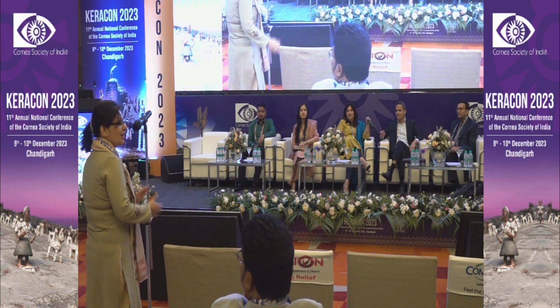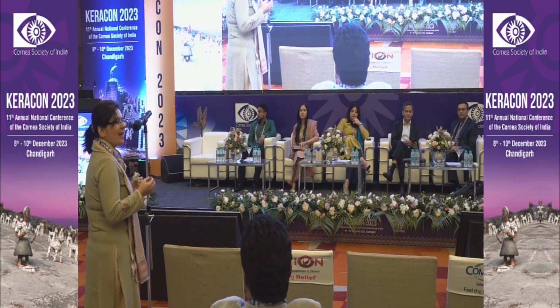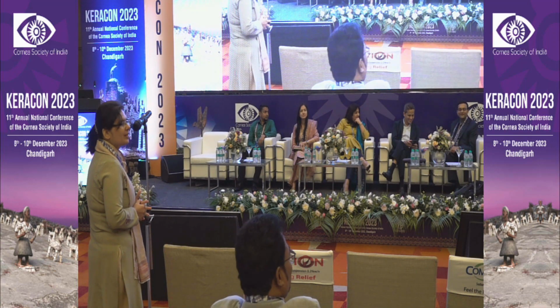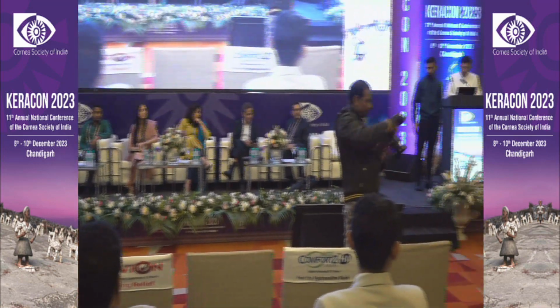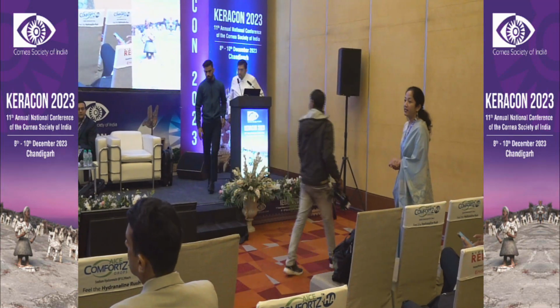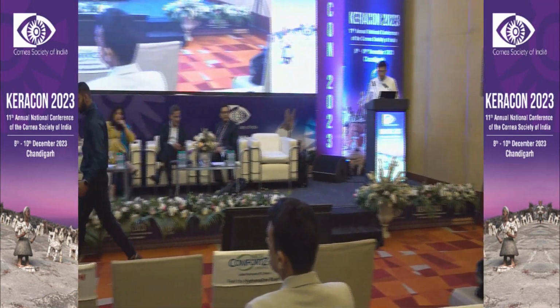Again for Dr. Mona, suppose that patient would not have been lost to follow-up. Otherwise, what was the plan? How would you remove that? Actually, the plan would have been to remove it when it was going to the anterior chamber, before it penetrated and entered into the anterior chamber, from the side port. Usually they are not visible under the microscope.